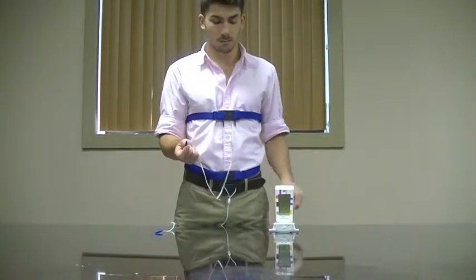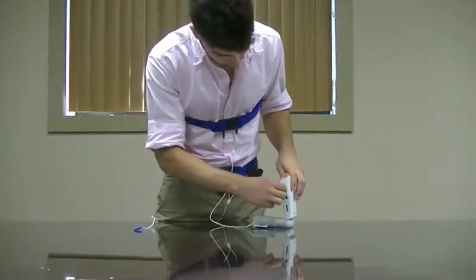Now you will want to attach the blue wires from the straps to the blue position on the side of the device.